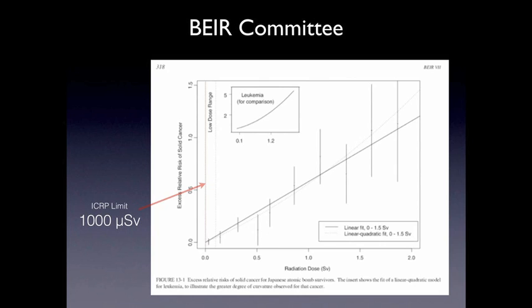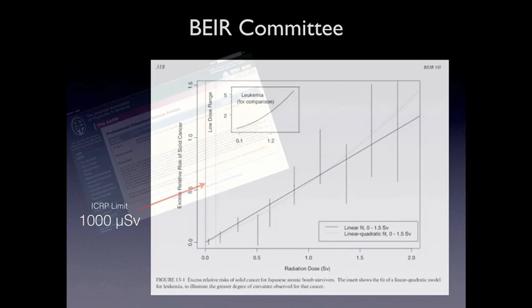And with most of our CBCT scans, we are then operating at 1/10 of that 1/100th. So again, we are operating in a very, very low dose range where even at 100,000 microsieverts, most of these committees are saying that the calculable risk of cancer is unfortunately impossible.